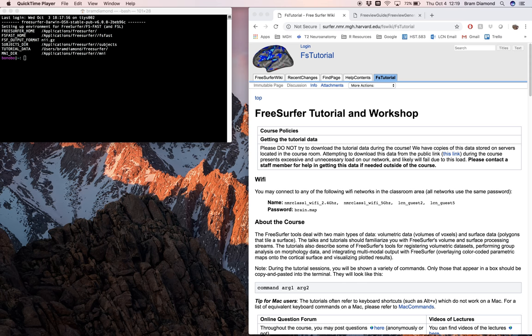We'll be using FreeSurfer's GUI-based viewer and editor for volume and surface files. You can get the full command to set up FreeView and follow along by going to the course schedule page and clicking on the demo link by my name.